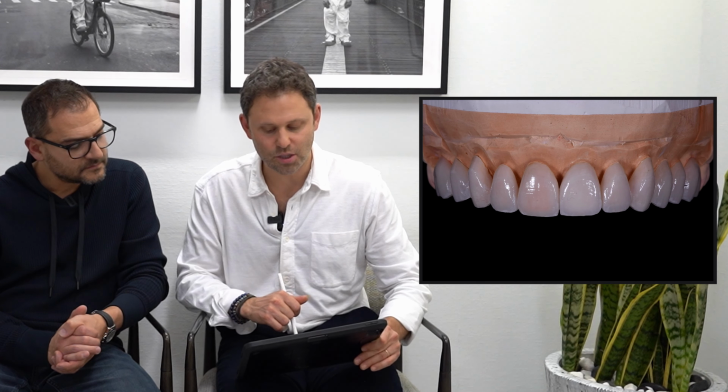So I started here with the temporaries, we peaked it even nicer. So if we look at how this tissue is, we're actually able to peak it even higher to get rid of that slope. And you can see it in the next photo that basically within my first temporaries, before I even did, because I have to then take these temporaries off, re-prep the case, and put in the veneers. And so utilizing the first framework to get to the final framework to finally get to our veneers.